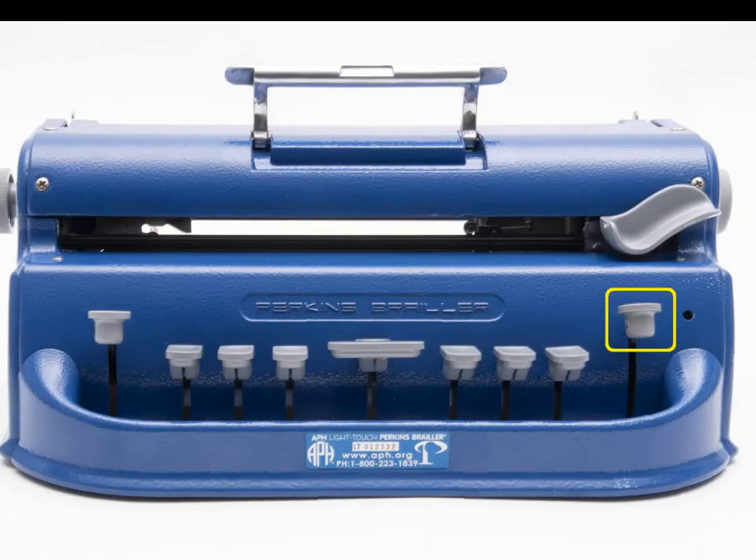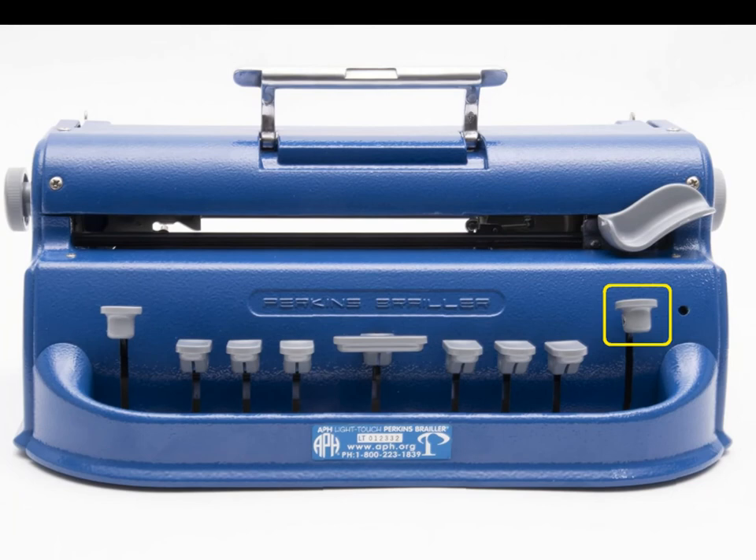The next key is the backspace key, which is responsible for moving one whole spot backwards, just like how the backspace key works on a laptop.